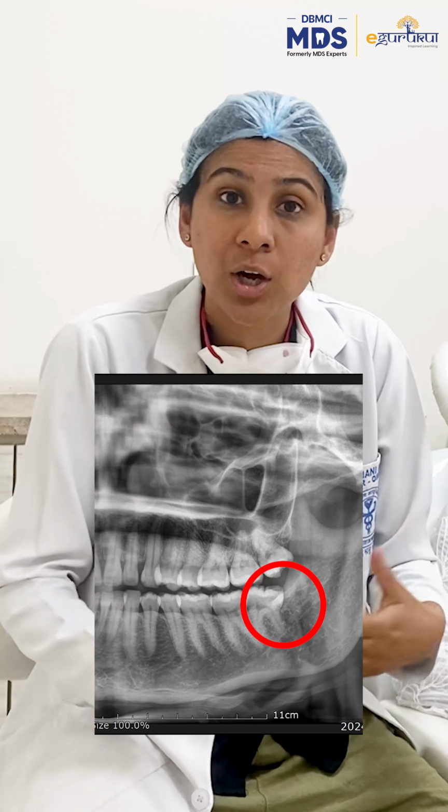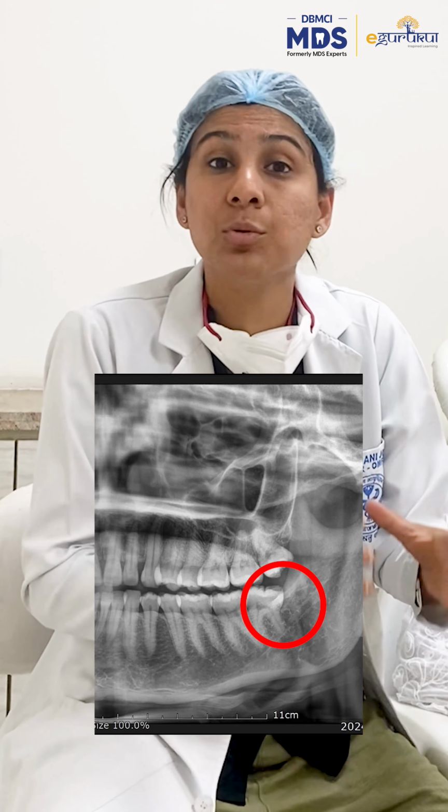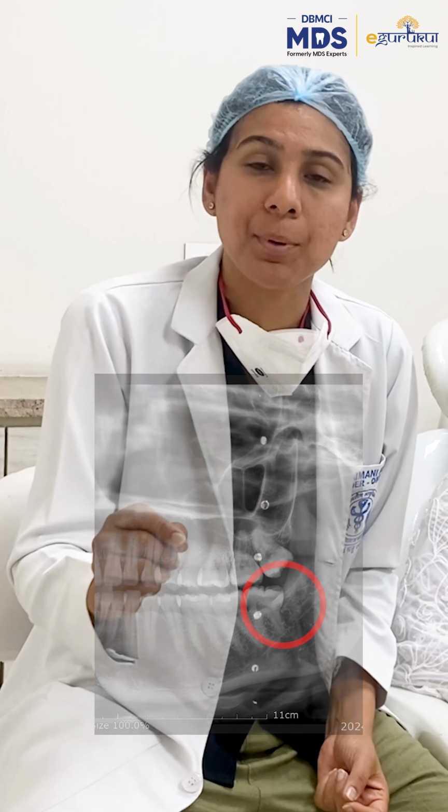And we have a patient today where we're going to learn the extraction of an erupted mandibular third molar. Now in this patient, the third molar is erupted, but still it is covered distally with some soft tissues. So as new doctors, sometimes we are not so confident of whether we will be able to handle this case or not. So come, let's learn step by step everything about how to extract a third molar in the mandible. Plus, I'm going to tell you one secret tip of luxating this tooth.